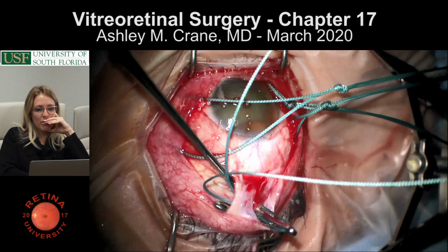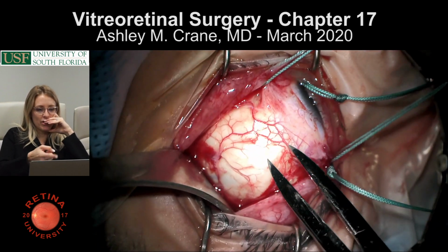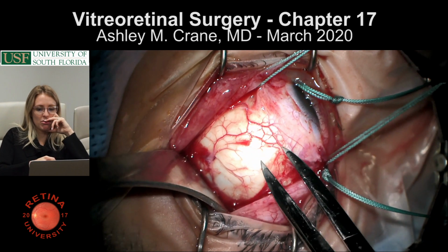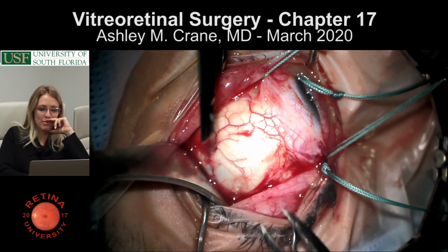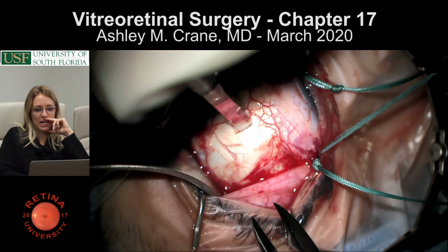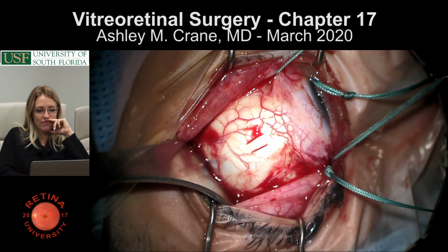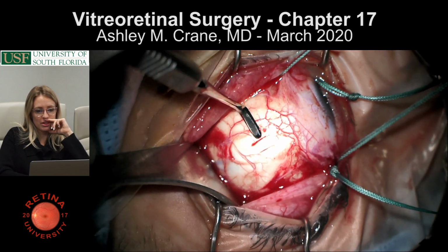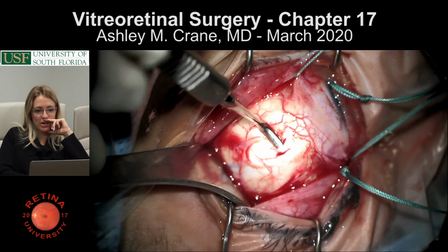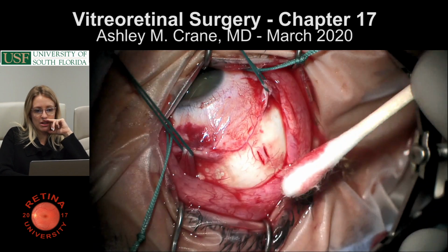And then there are a couple ways to put the buckle around. The first part of the video will show what I usually use, which is making scleral tunnels, and basically using a blade to make a little tunnel, and then, well, you'll see. So 2 little parallel partial thickness sclerotomies, and then an instrument that connects them.